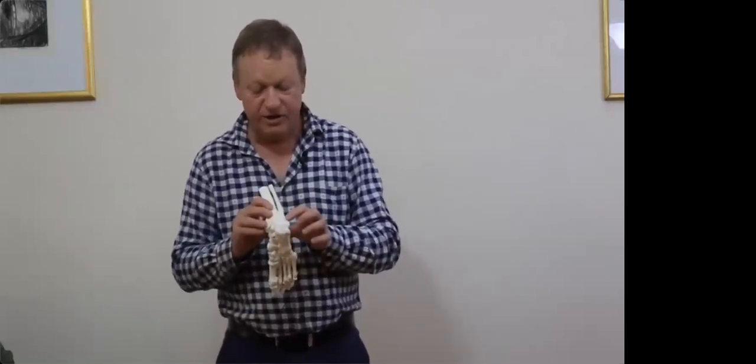If that fails, it may also fail in association with the posterior counterpart, the posterior inferior tibiofibular syndesmosis, and this runs at almost a mirror angle in the posterior ankle. And then, of course, there's another structure, the interosseous membrane that sits between the tibia and the fibula, running up through the calf here, and that can tear as well. So these are what we call a high ankle sprain. And the one that we most commonly see fail is this anterior inferior tibiofibular syndesmosis.